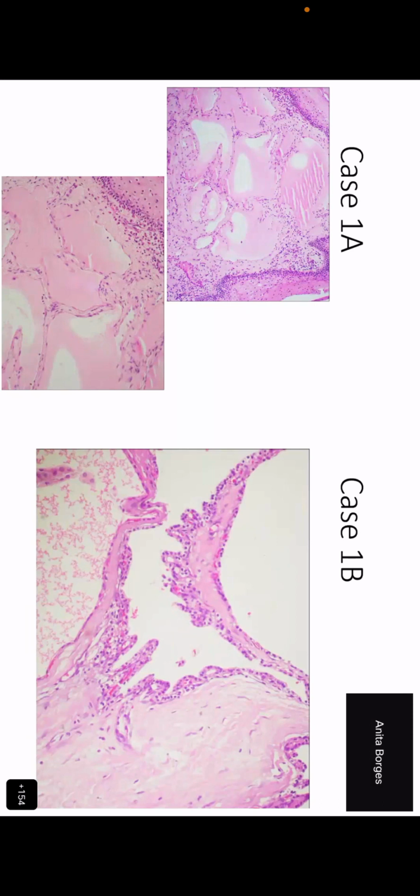You're not sure, but you persisted in calling it an epithelium, despite the fact that they said it was an endothelium. So now tell me, you must have some very deep-seated reason. Okay. In the meantime, is anybody in the chat box, please ask them to answer, or I'm asking them and they can answer.